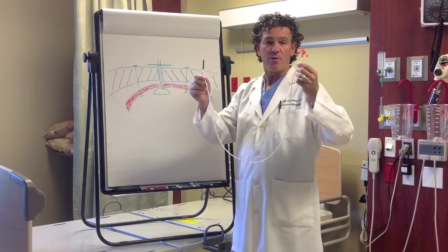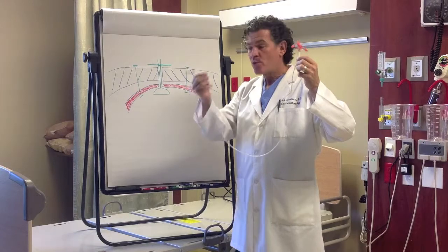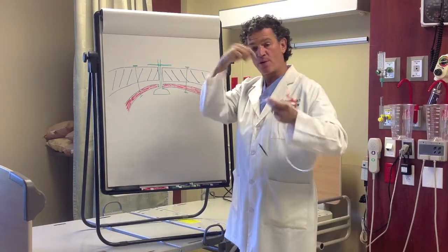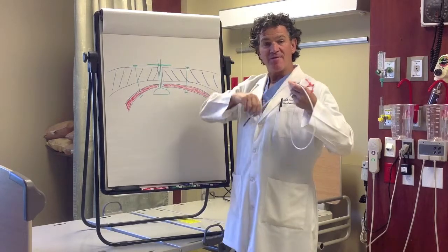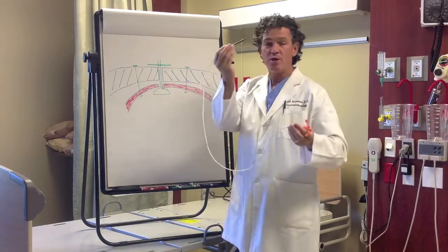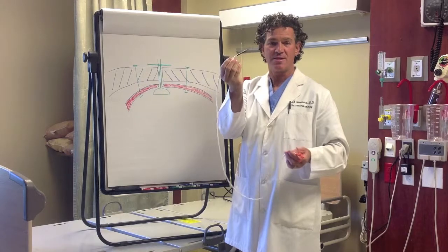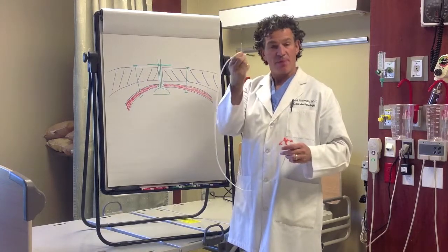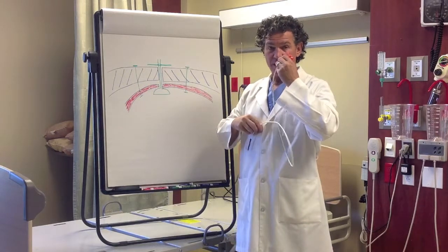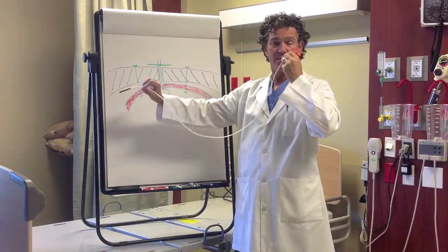The benefit of the fluoroscopy and doing it with an endoscopy is that we can take the tip of this tube and either using the x-ray machine or with the camera, the endoscope in the stomach, advance the tube into the small intestine. When it's done at the bedside, you really don't have any control over where the tip of this goes. If you get it through the stomach into the small intestine, then you got really lucky. They're really designed, when placed at the bedside, to basically get it into the stomach and then let the person's peristalsis push it down into the small intestine.